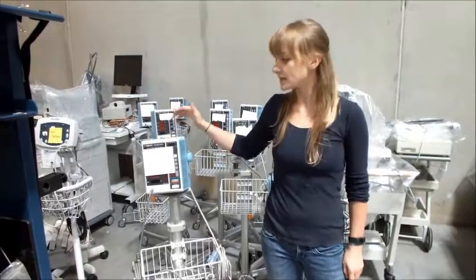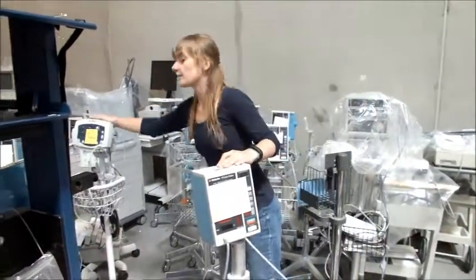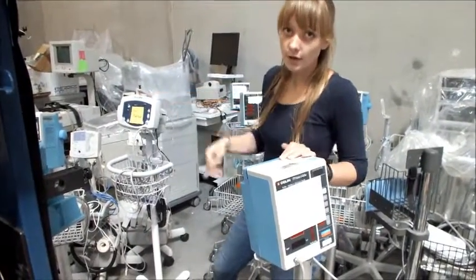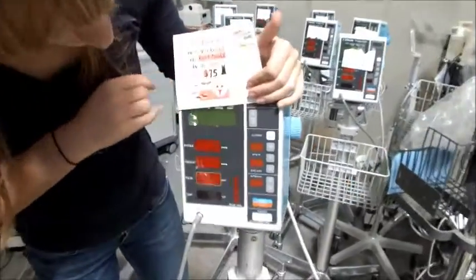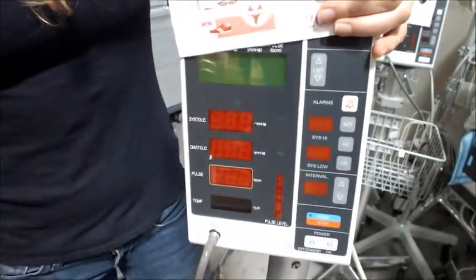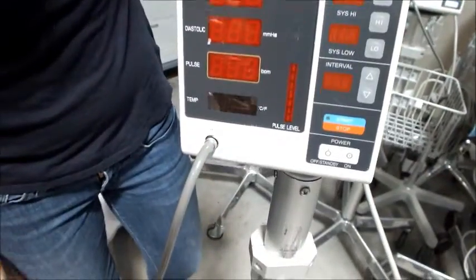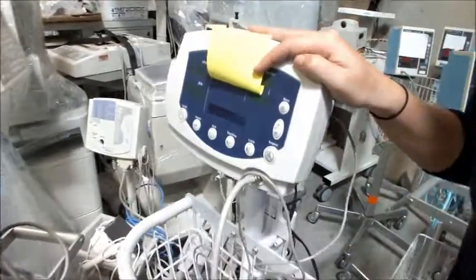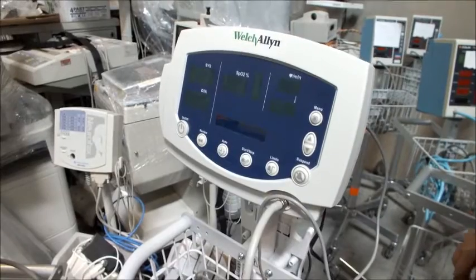Blood pressure machines come in all different shapes and sizes. As you can see, you have two different kinds of blood pressure machines right here in the back of the warehouse. What you're going to need to look for are words like systolic and diastolic, or if you can see an attachment for a blood pressure cuff. Pictures of an arm with a band on it are also good indicators that the machine you have is a blood pressure machine.